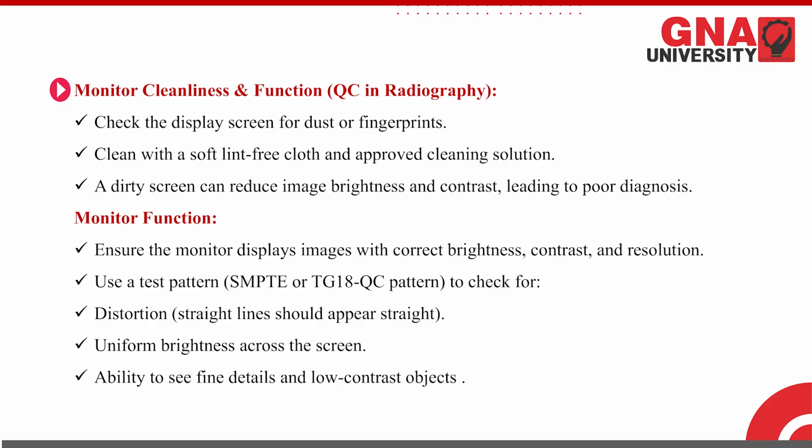And any dirty screen can reduce the image brightness and the contrast, which can lead to misdiagnosis, or we can call it poor diagnosis. And what monitor functions do we have to check?